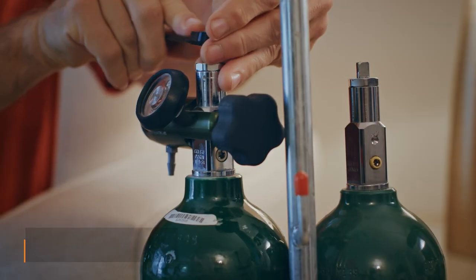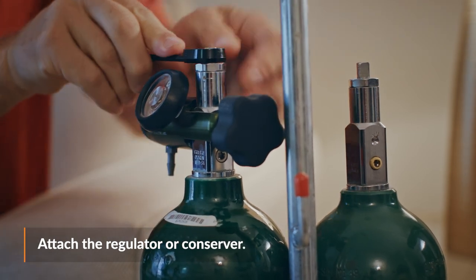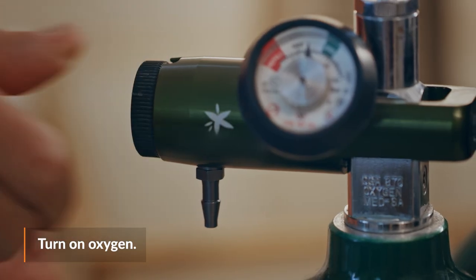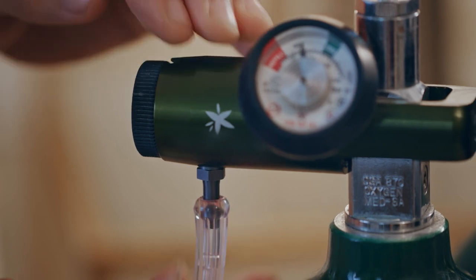To get started at home with a metal tank, attach the regulator or conserver if you use one. Then, attach your nasal cannula or face mask and turn on the oxygen to the prescribed flow rate. Remember, if you're using a conserver, you won't feel oxygen flow out of the nasal cannula until it is connected and you take a breath.